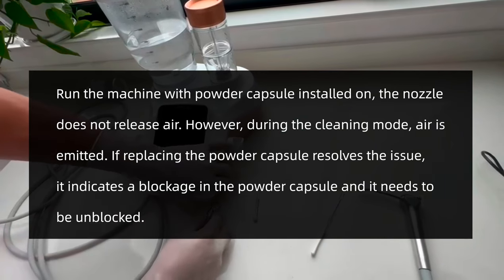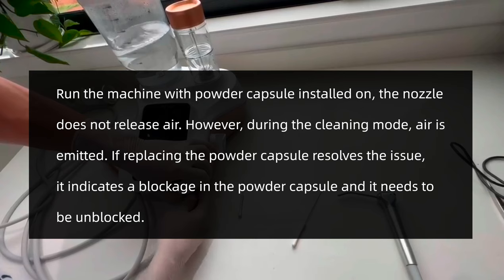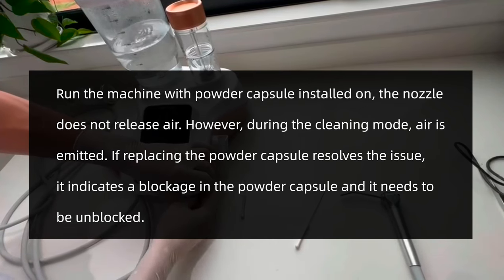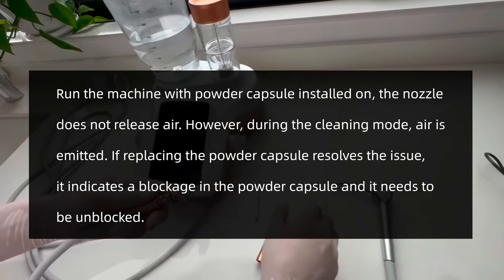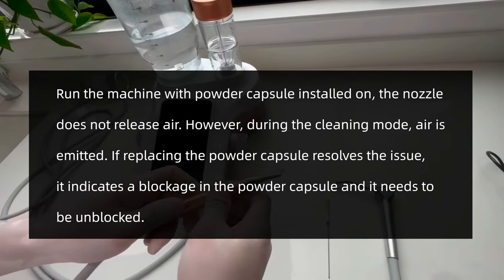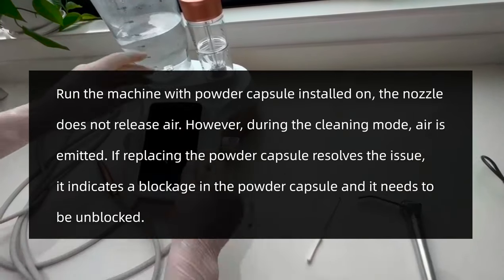Run the device with the powder capsule installed. The nozzle does not emit air; however, during the cleaning mode, air is emitted. If replacing the powder capsule resolves this issue, it indicates a blockage in the powder capsule and it needs to be unblocked.